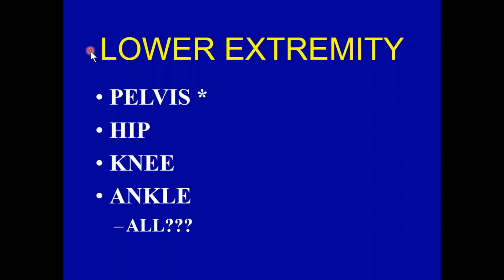So when you do that, this is the ancillary examination. The pelvis examination, the cassette goes 1 inch above the iliac crest. Center your central ray with the middle of the pelvis. No collimation required on this examination. It's the only one that in standard radiographic positioning class, whether it was chiropractic, medical, or otherwise, is acknowledged to be the only examination that doesn't require gonadal shielding and or collimation.